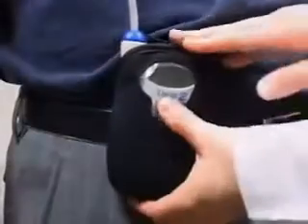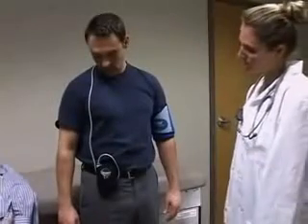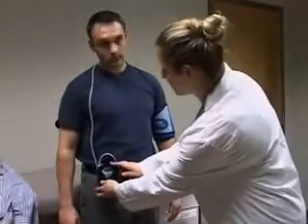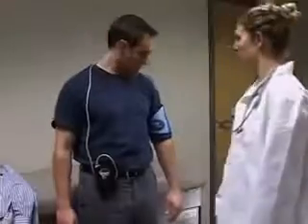Before testing, be sure to take at least one reading to verify proper setup. Turn the monitor on by pressing the start-stop key. Wait for the display and then press the start-stop key to take the first reading. This will begin the study.